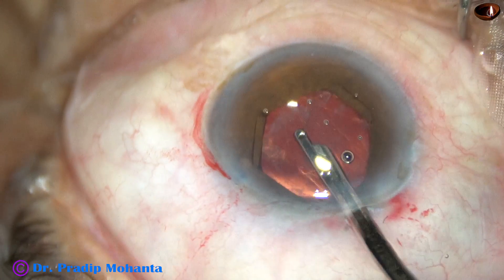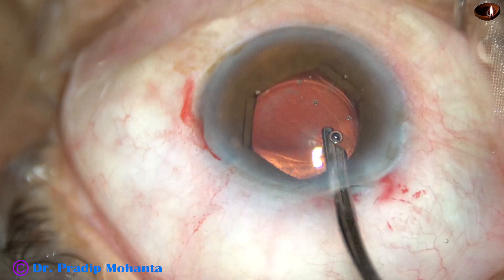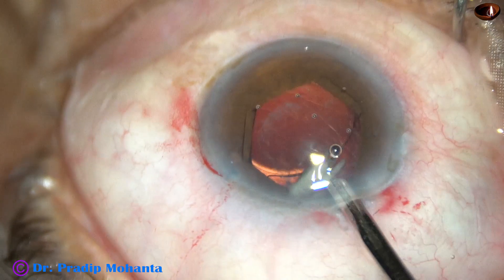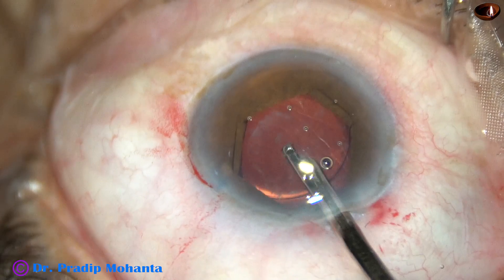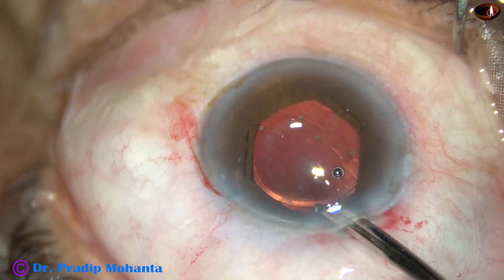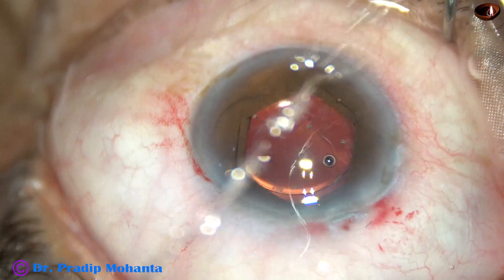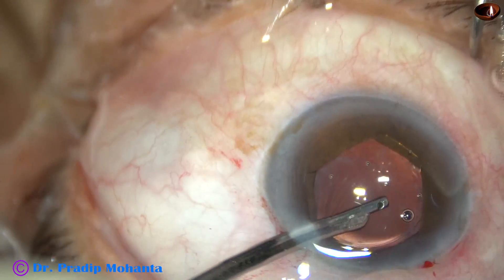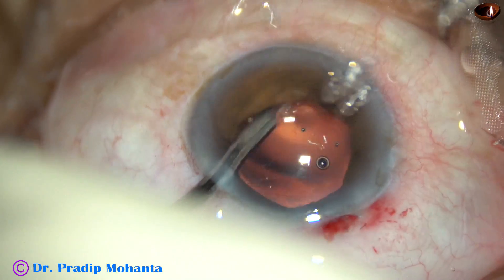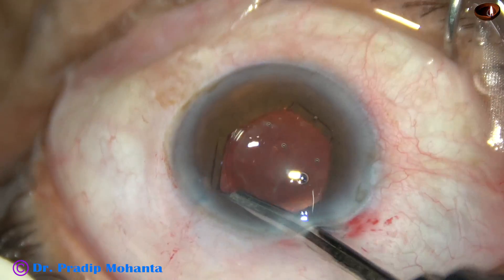And now I am going to remove the cortex. With the intraocular lens in the bag, it is not at all difficult to remove the cortex. With CTR it may be difficult, but with the intraocular lens in the bag it is not at all difficult — by simcoe, bimanual irrigation aspiration, or coaxial irrigation aspiration. In this case I have only one sideport, so I used a simcoe cannula.